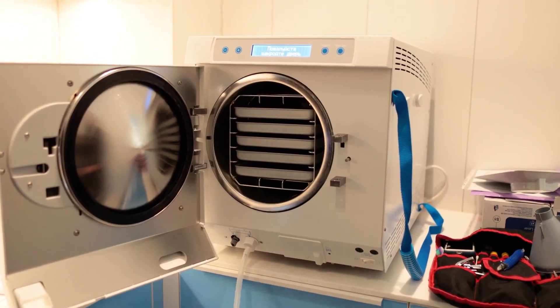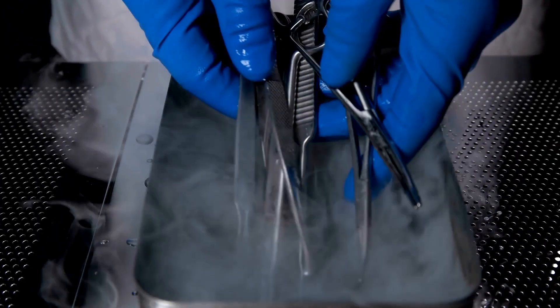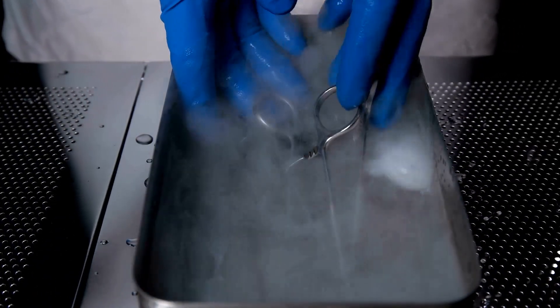With gravity displacement, steam enters from the top or sides of the sterilizer and pushes the air out down through the drain. With pre-vacuum, a vacuum pump sucks out air first, then steam rapidly fills the chamber, which is much more efficient.